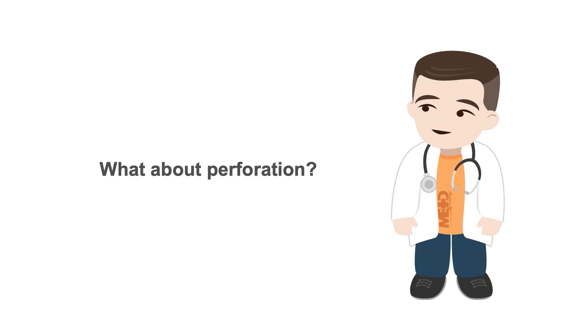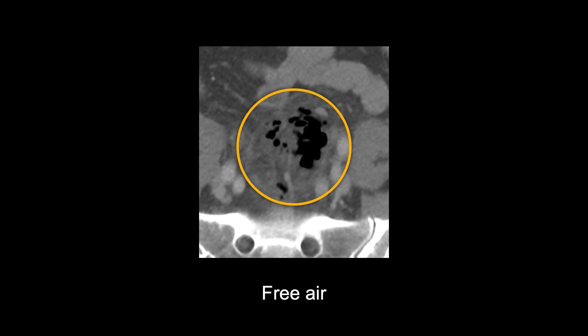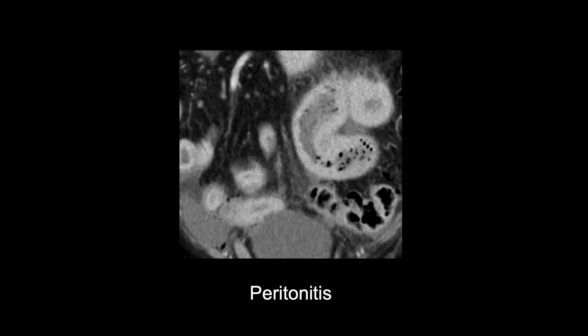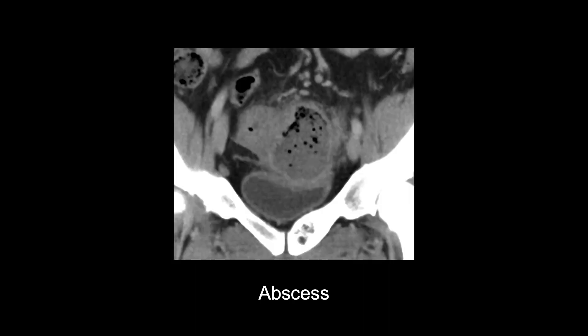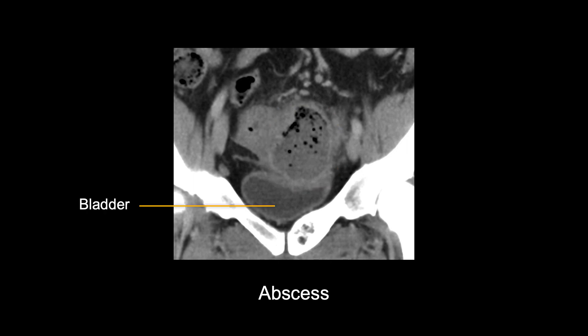What about complicated forms of diverticulitis, as in the case of perforation? If a perforation has occurred, you will see three additional findings. These include extraluminal or free air, which will look like black dots outside of the bowel and is usually easiest to see on bone or lung windows. You will also see peritoneal inflammation resulting from spillage of stool from the perforation — in this example, the small bowel loops are thickened and inflamed, indicating peritonitis. And lastly, abscess formation, which typically appears as an enhancing collection with fluid, air, and debris. Notice how the abscess sits on the bladder and causes the bladder wall to indent and become thickened due to reactive inflammation.